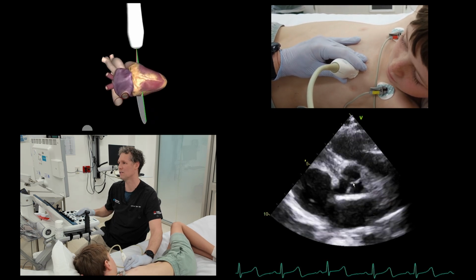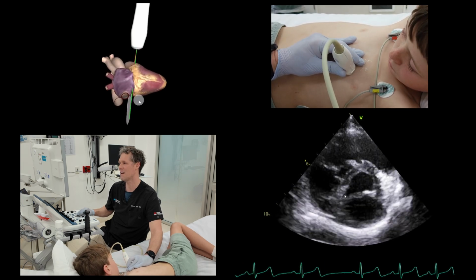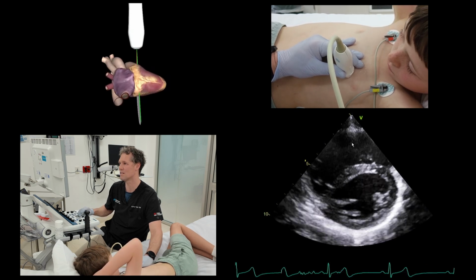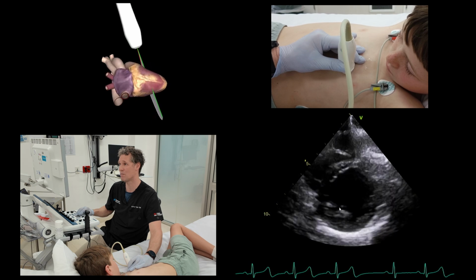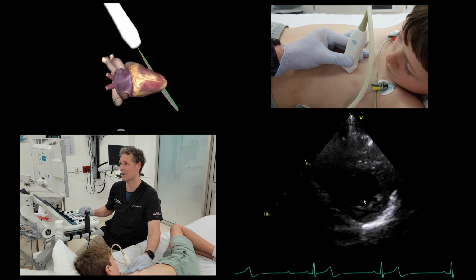So there's our aortic valve, left atrium, right atrium. As I fan down, there's the mitral valve, anterior and posterior mitral valve leaflet. Here's the left ventricle, there's the right ventricle. Fan down to the mid-ventricle level with the anterolateral and posteromedial papillary muscles, and down to the apex, and I lose those papillary muscles, and you can look at the apex.